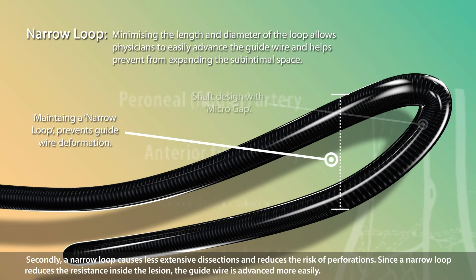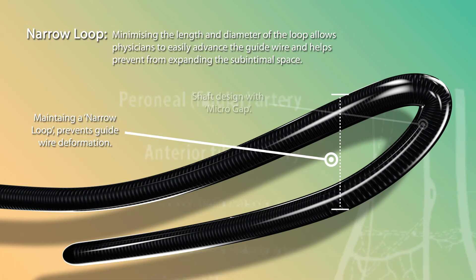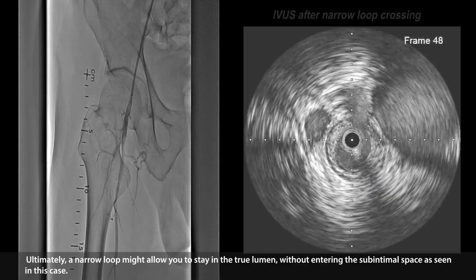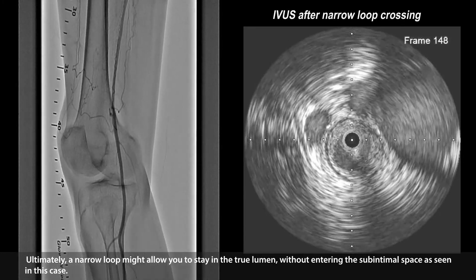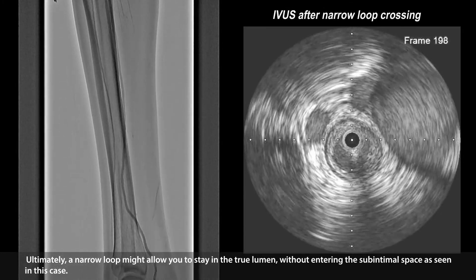Secondly, a narrow loop causes less extensive dissections and reduces the risk of perforations. Since a narrow loop reduces the resistance inside the lesion, the guide wire is advanced more easily. Ultimately, a narrow loop might allow you to stay in the true lumen without entering the sub-intimal space, as seen in this case.